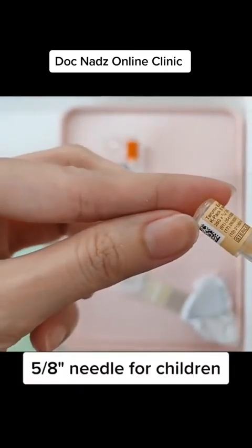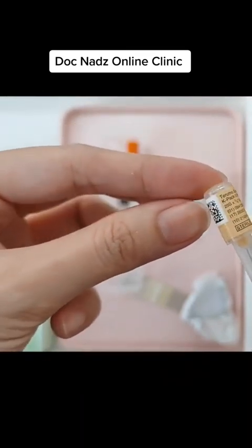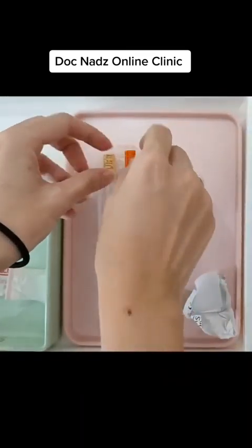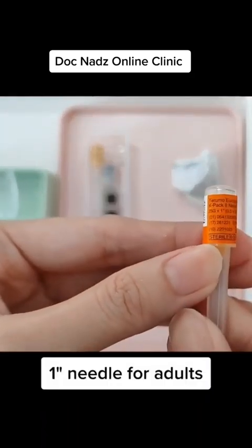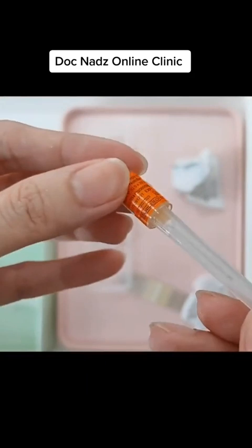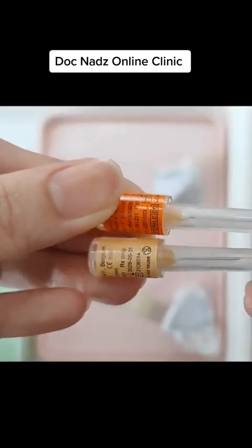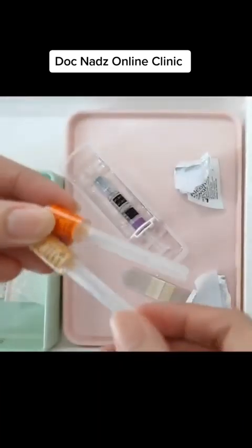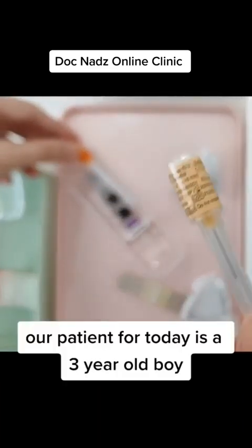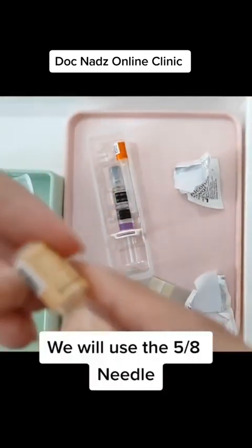This is a 5/8 inch needle that will be used for children. This one is a 1 inch needle that will be used for adults. You see the difference? The 5/8 inch is shorter in length. Our patient today is a 3-year-old boy, so we will be using the 5/8 inch needle.